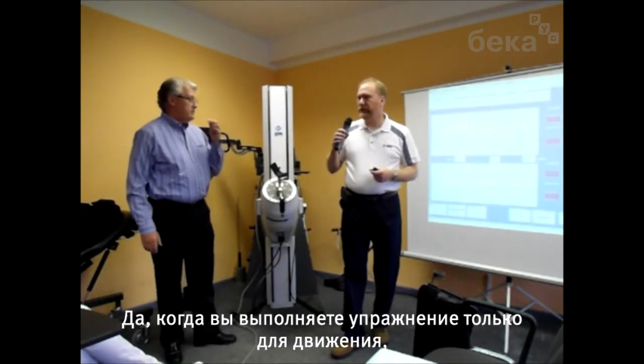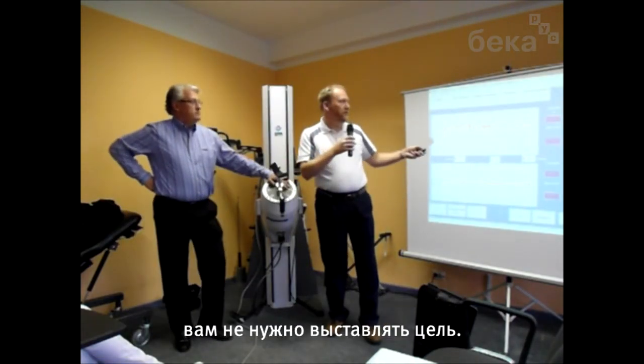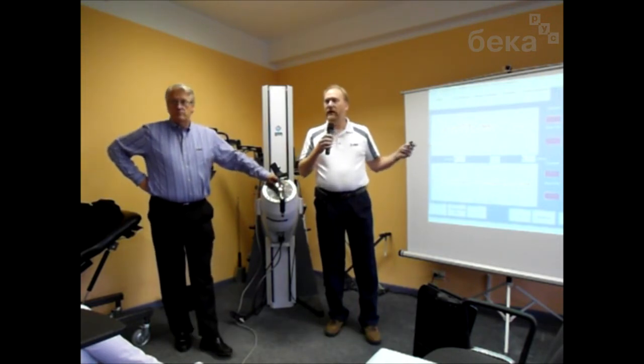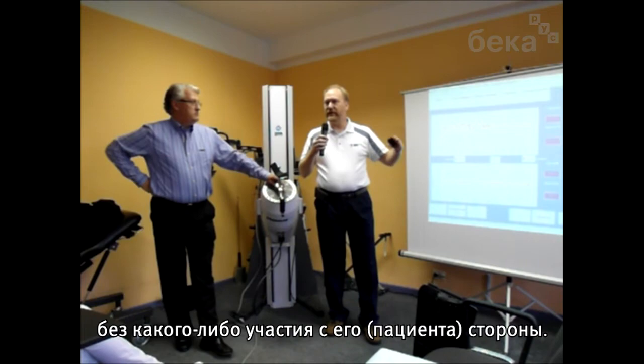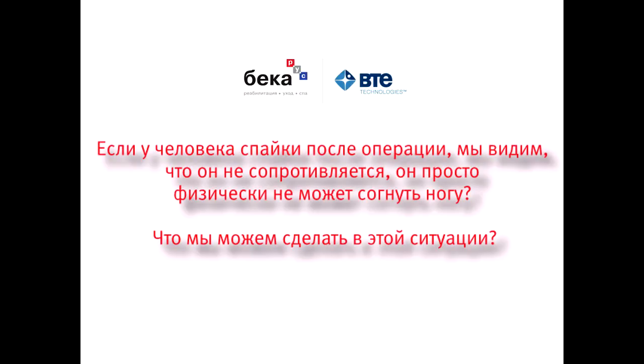Yeah, when you're doing it just for the motion, you do not need to set the target. You can just let the machine move the person's limb without any participation of the person.